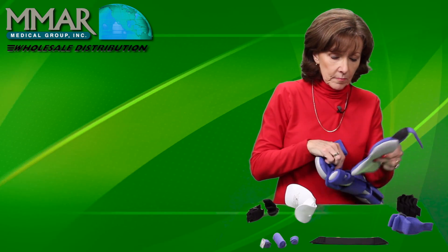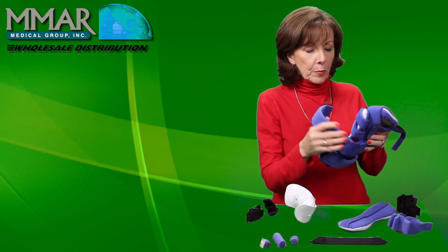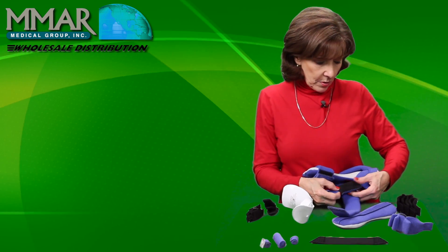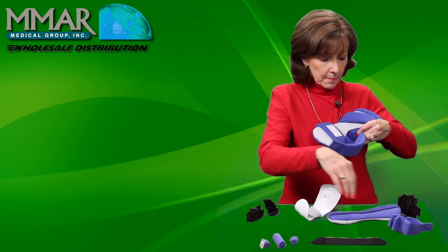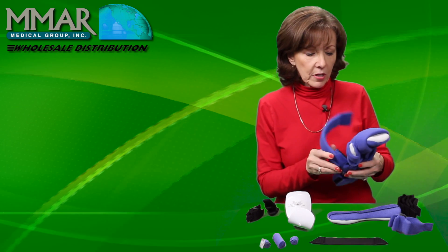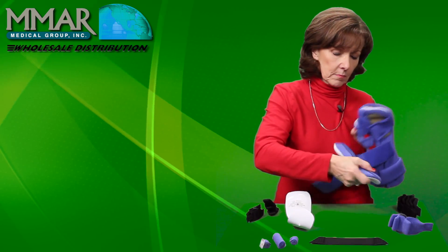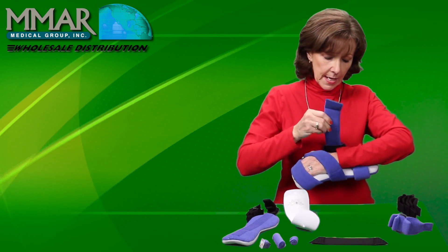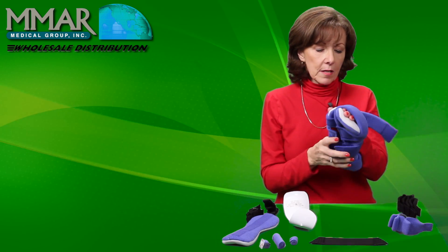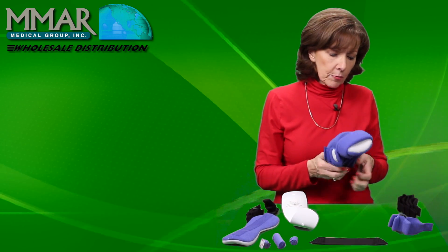To address wrist ulnar drift, you open this up on the wrist and place this little pillow right where the edge of the splint ends, tucking it around with velcro. You can put this anywhere you have a problem, but for ulnar drift you would put it right there. When you put the hand splint on, it gives that nice tug, bringing the wrist over and aligning it. Without that addition, there's just not enough tug to effectively realign the wrist.